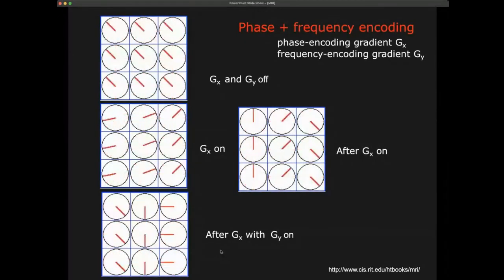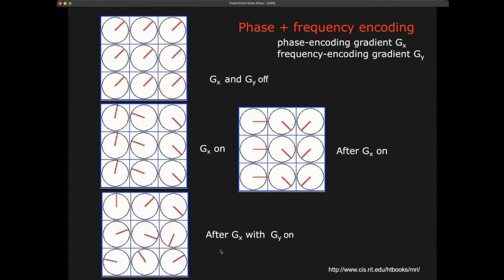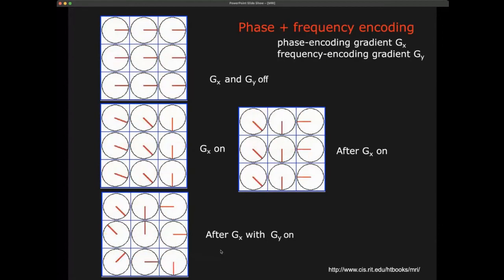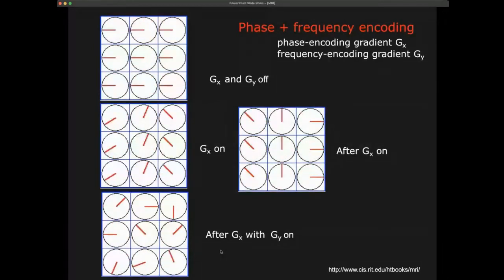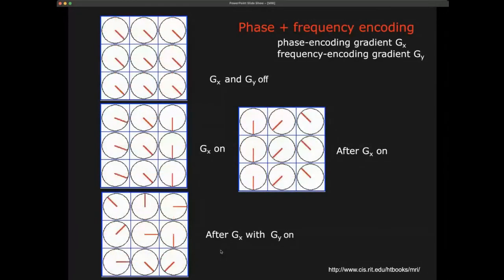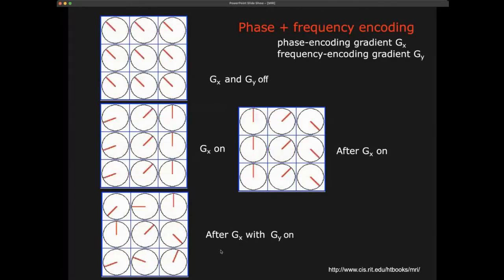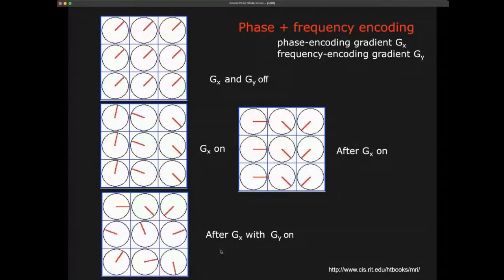And there you're right. So what we actually do, and that comes in a minute, is we do different lengths of an extra gradient so that every time we dephase a little bit more, and then we use all these different measurements that are taken at different dephasings, and then we can decode it later on and reconstruct. Okay, thank you.